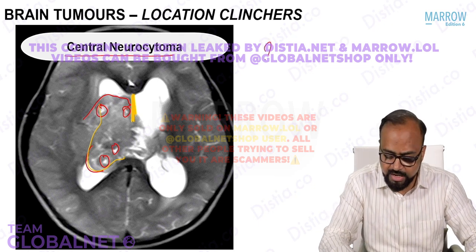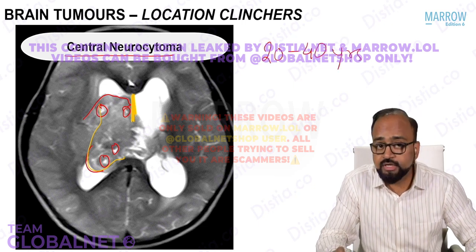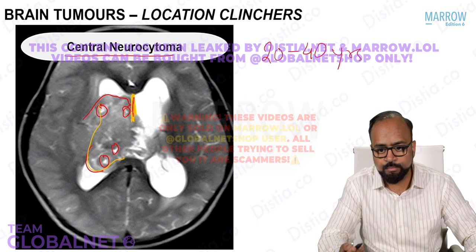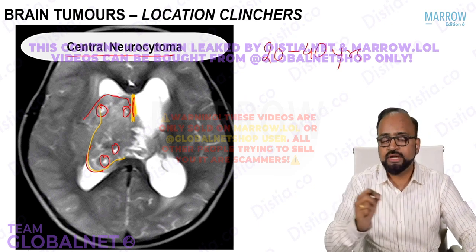It is usually seen in adults in around 20 to 40 years age group. It is located in the body of the lateral ventricles. It has multiple cysts, so it appears bubbly. It is usually closely attached to the septum pellucidum. So this also leads to hydrocephalus. This is the central neurocytoma.